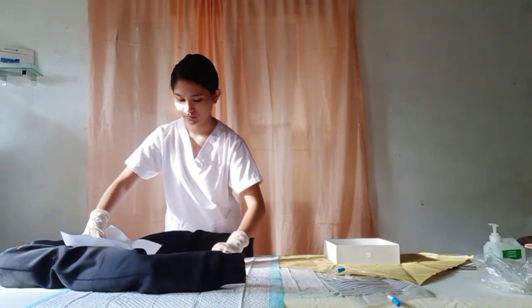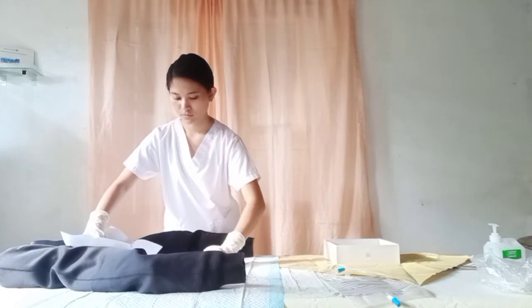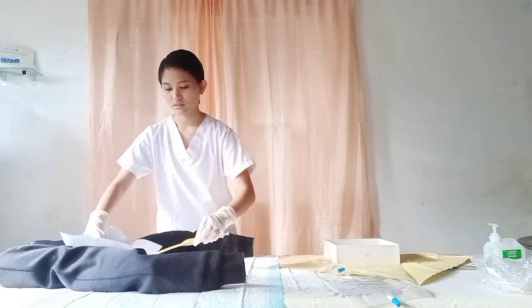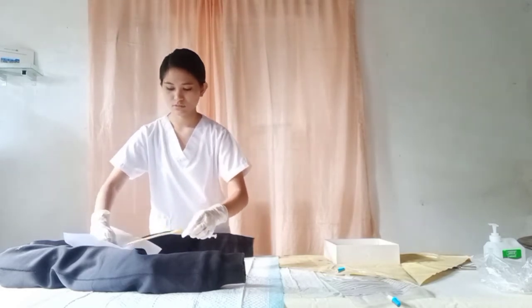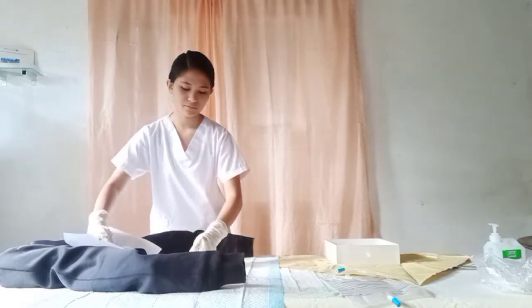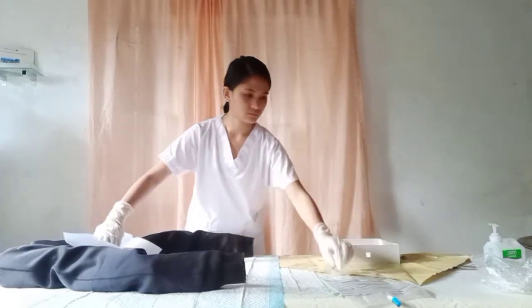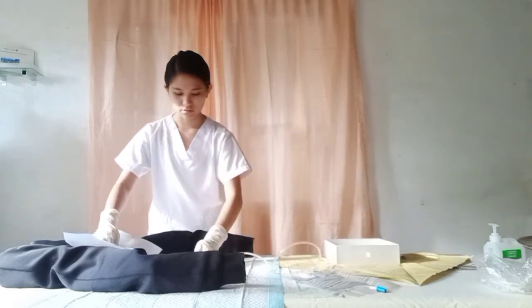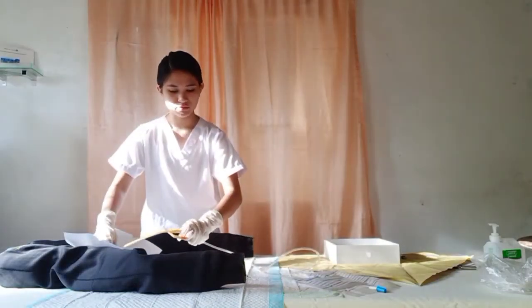Okay. Test if the catheter is already in place. If it is locked, hold it with your non-dominant hand. Hold the tubing with your non-dominant hand. And then discard this. And then attach the tubing to the catheter. Then observe the flow of the urine.